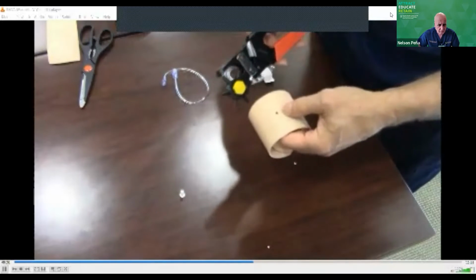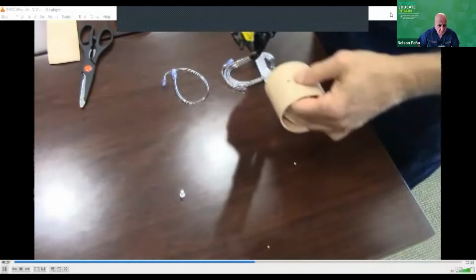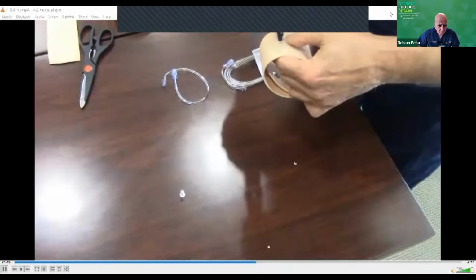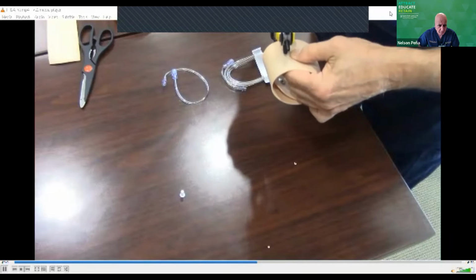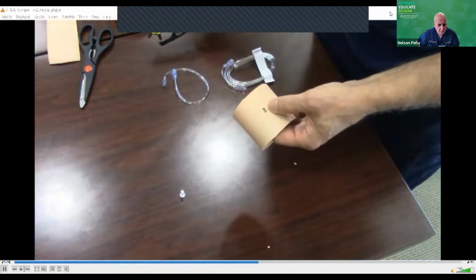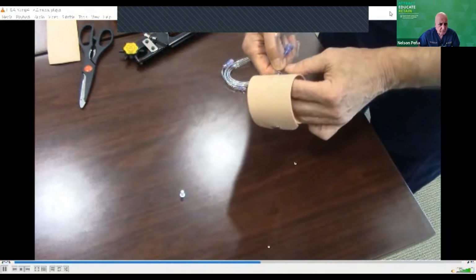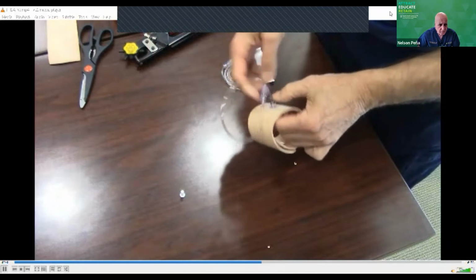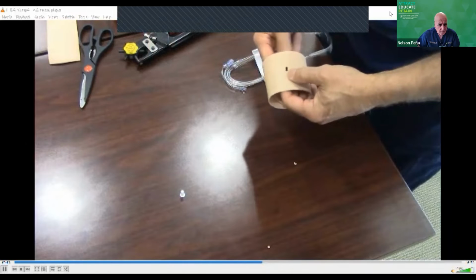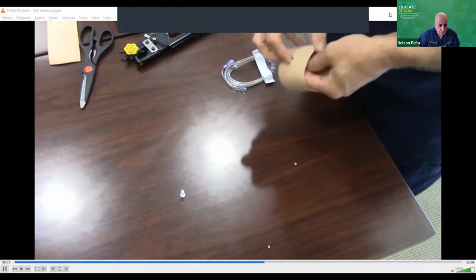So what helps you to do that is to make it oblong. So if you put a couple of holes right next to each other, like so, that'll make it easier for you to get the piece through there. Still a little tight. Go in from the inside and see if I can't pull it through.